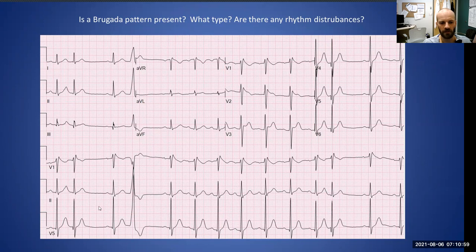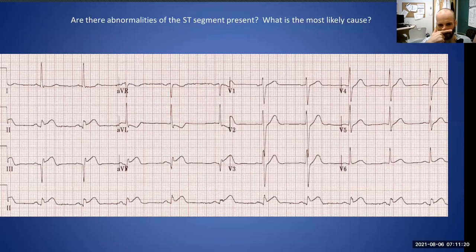Okay. So we've got sinus rhythm. We do have an AV relationship, but it's perturbed by the fact that we've got some PVCs and these early atrial beats as well. That's a little bit of a tricky one to interpret the rhythm there. So good effort, but you're certainly right about it being a type two Brugada pattern. So that was the main point of it. Okay. Next.